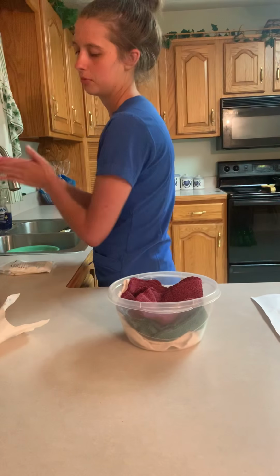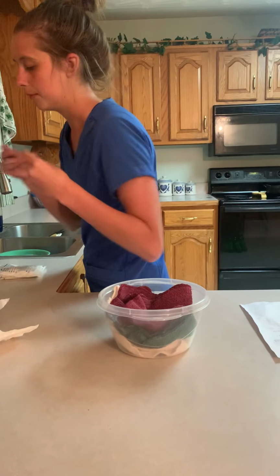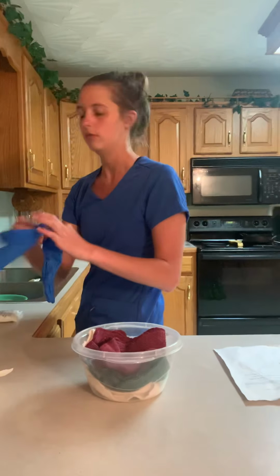So first what I'm going to do is raise the bed up to the appropriate level, and I'm going to lower the side rail that is closest to me. And next what I'm going to do is come over here and wash my hands again, and I'm going to get 2 clean pair of gloves.